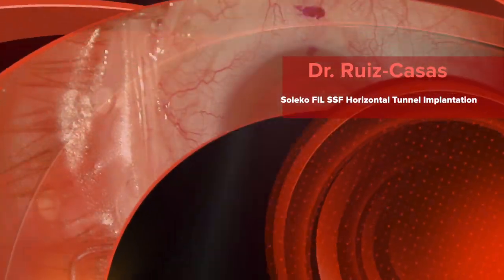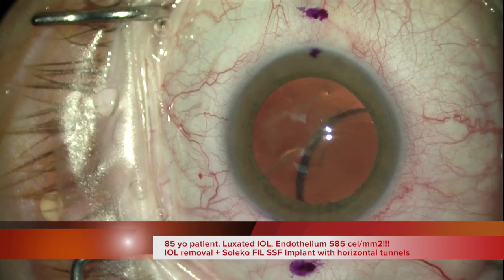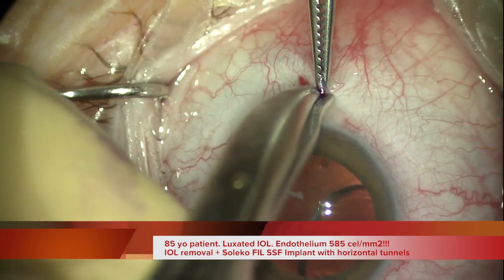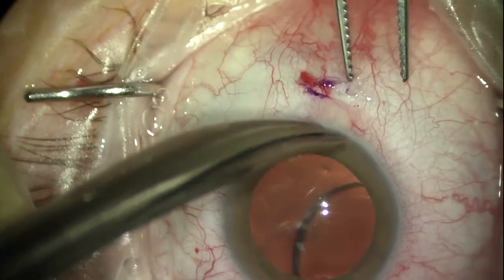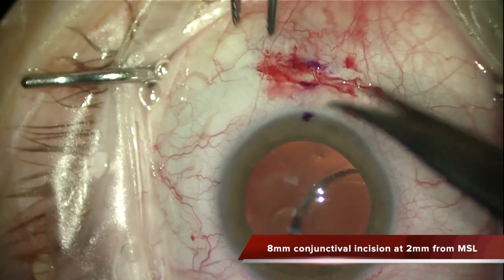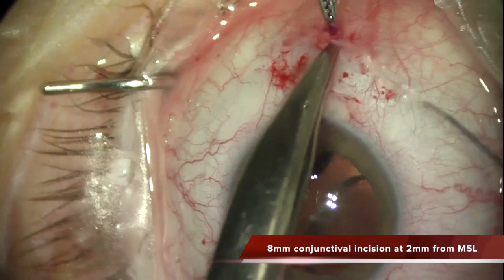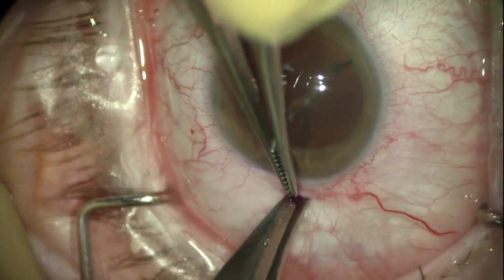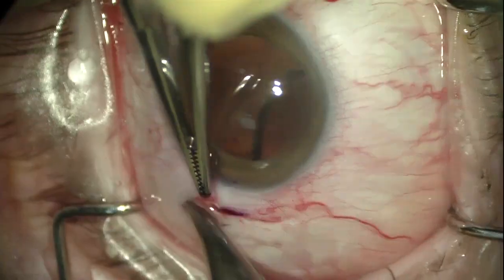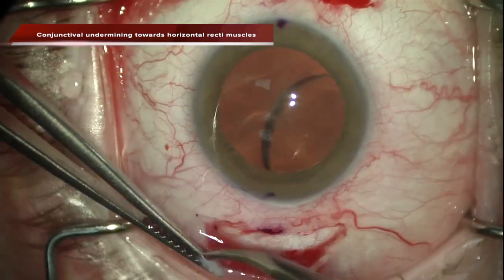This video shows a new implantation technique for the Soleco scleral fixated IOL. This was a patient with a very low endothelial count and a dislocated intraocular lens. The plan is to remove the IOL and implant a scleral fixated Soleco IOL. But the patient is quite old, and in this case the conjunctival dissection and posterior reconstruction can be difficult. So I decided to change the technique and implant the IOL with scleral horizontal tunnels.